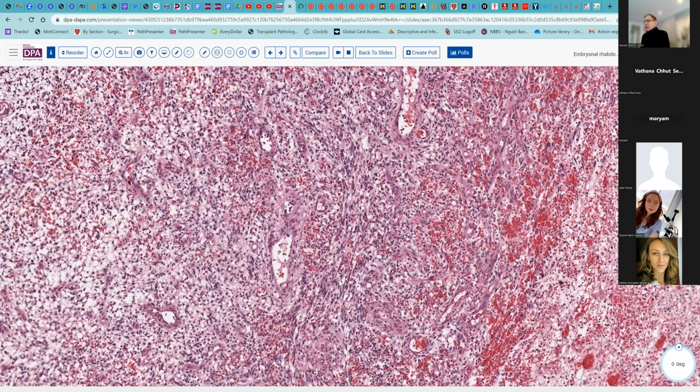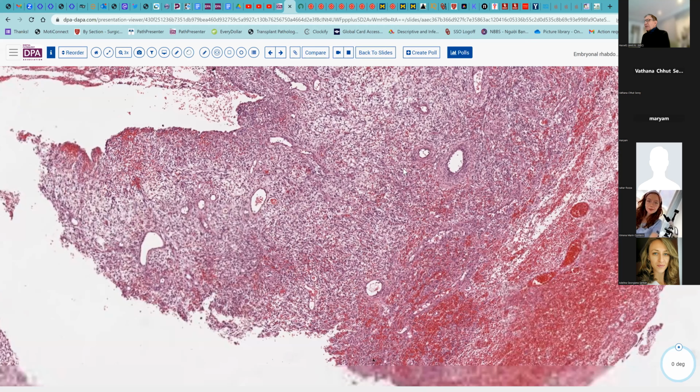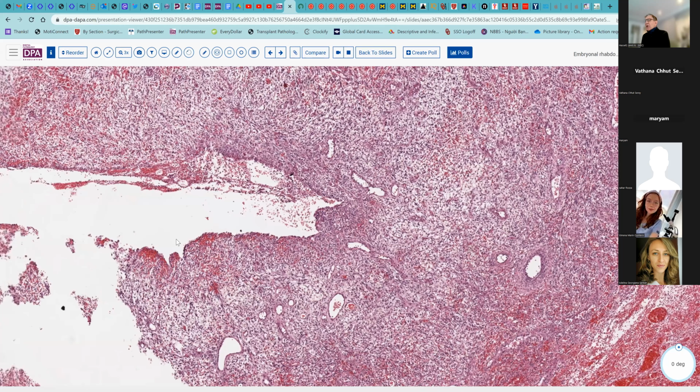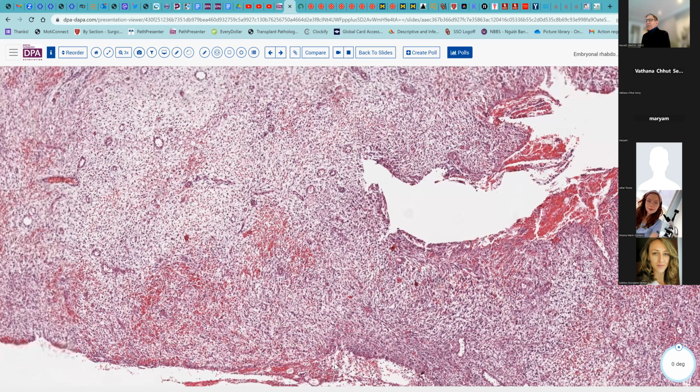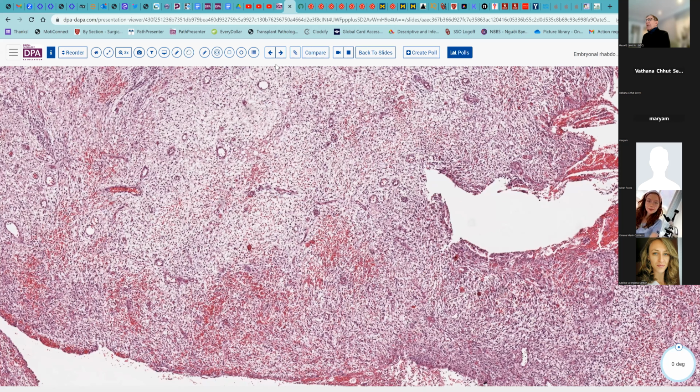But doing the immunohistochemical stains for myogenin or other myoid markers, you should be able to detect some myoid differentiation in this lesion. So it's not usually a clinical differential problem with the other lesions that we've earlier mentioned, but for completeness, I included it here as an example for you to be able to come back and look at a little bit later.